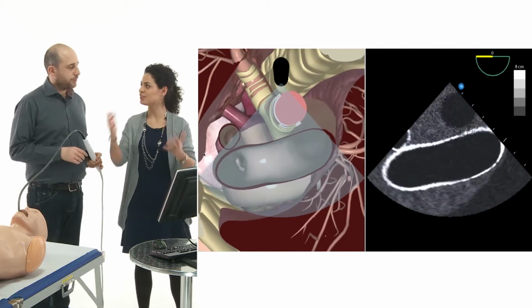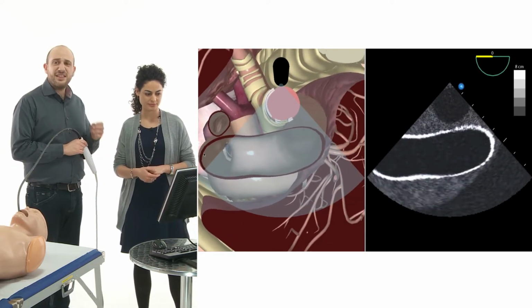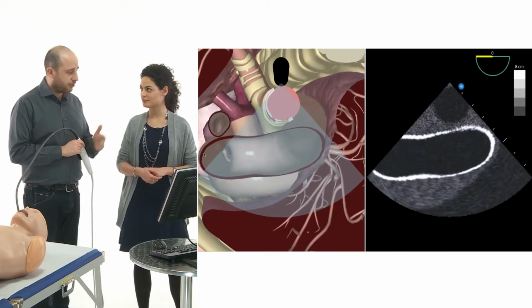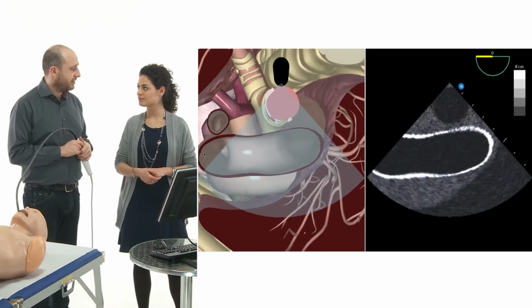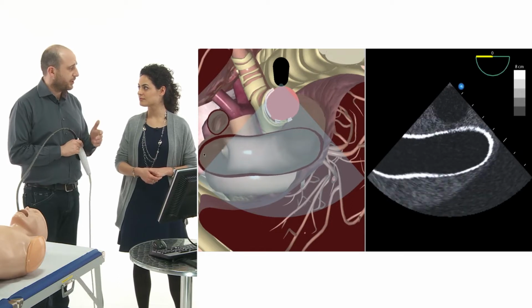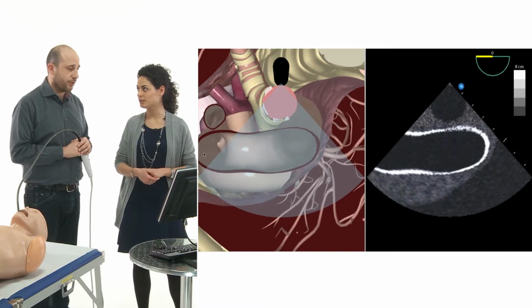Yeah, this means we are turning into the arch from the descending. Exactly. This is the easiest way to have the aortic arch on your screen. It's very easy, very fast, and especially for the diagnosis in patients with type A dissection, it's extremely useful.